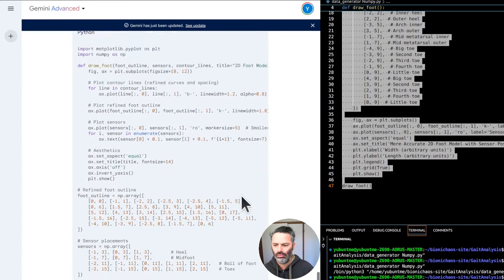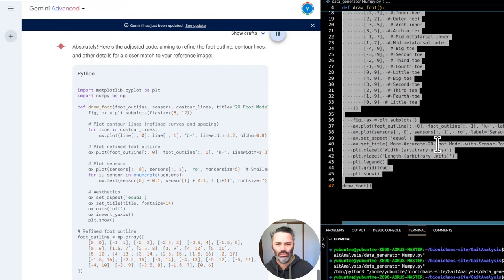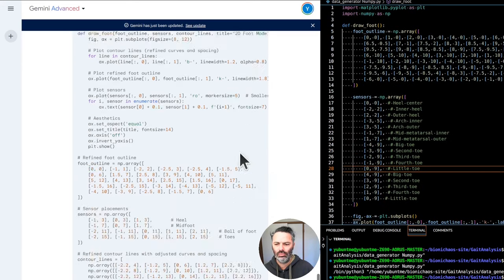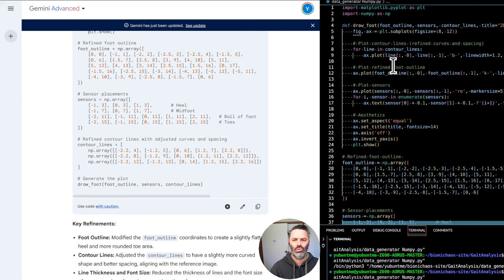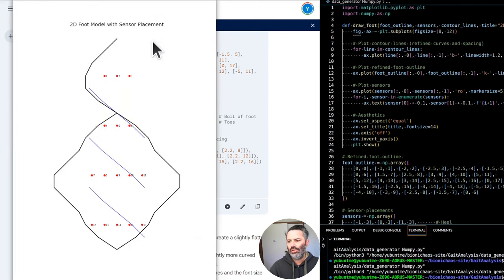Absolutely. Here's the adjusted code, aiming to refine the foot outline, contour lines, and other details for a closer match to your reference image. Key refinements: foot outline, modified the foot_outline coordinates to create a slightly flatter heel and more rounded toe area. Contour lines, adjusted the contour_lines to have a slightly more curved shape and better spacing, aligning with the reference image. Line thickness and font size, reduced the thickness of lines and the font size of sensor numbers for a closer match to the reference. Let me know if you'd like any further adjustments.